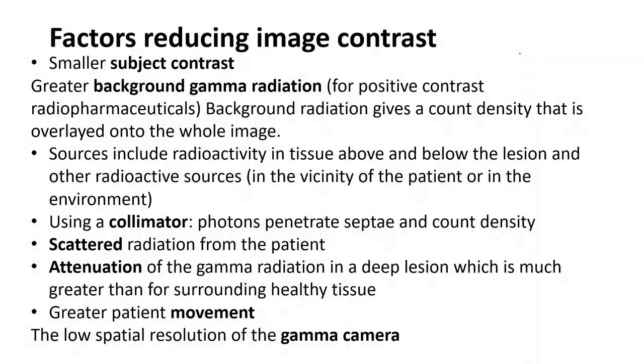All of this affects your contrast significantly, so even using a different collimator can drastically change things. For example, if you use a different collimator, your counts may increase or decrease substantially, which will affect the counts you obtained in a noticeable way. All of this has a considerable impact on you and your work.